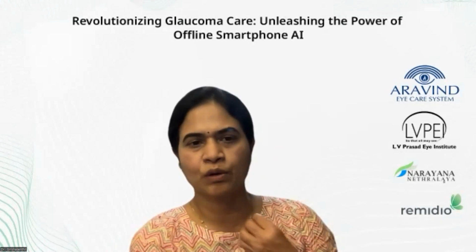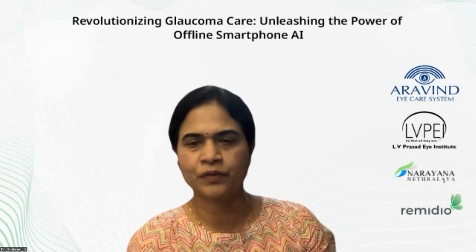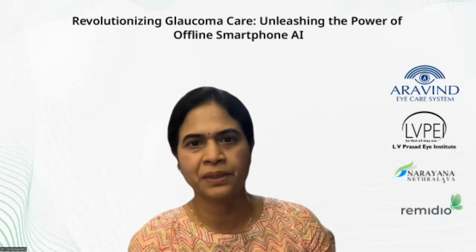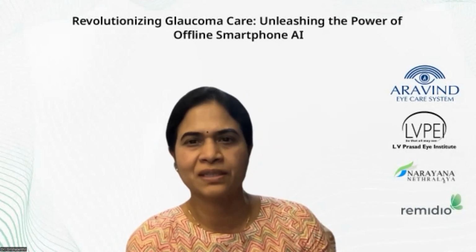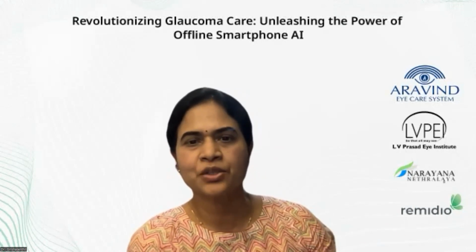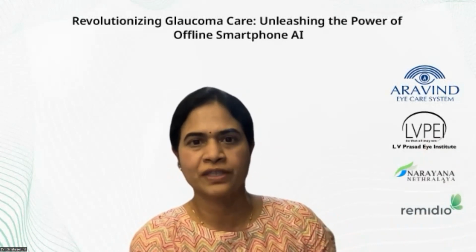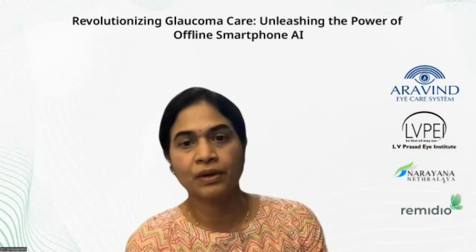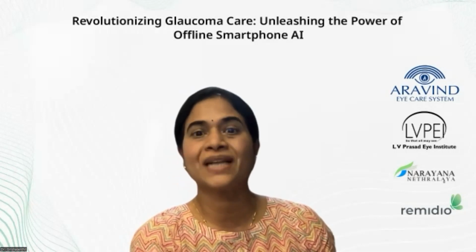But in patients with glaucoma suspect, a few of them, if the cup-to-disc ratio is too large, just like how all of us are not able to diagnose, you need additional information, you need visual fields, you need OCT, whatever. So I don't think you can expect an AI to say whether the suspect is actually glaucoma or normal. All it tells you is the vertical CD ratio is larger, and because of the CDR being larger, most of the suspects are so. And then it says that you need to keep a watch. So even if it says referable glaucoma or not a referable glaucoma, I wouldn't give too much importance to it at the moment.